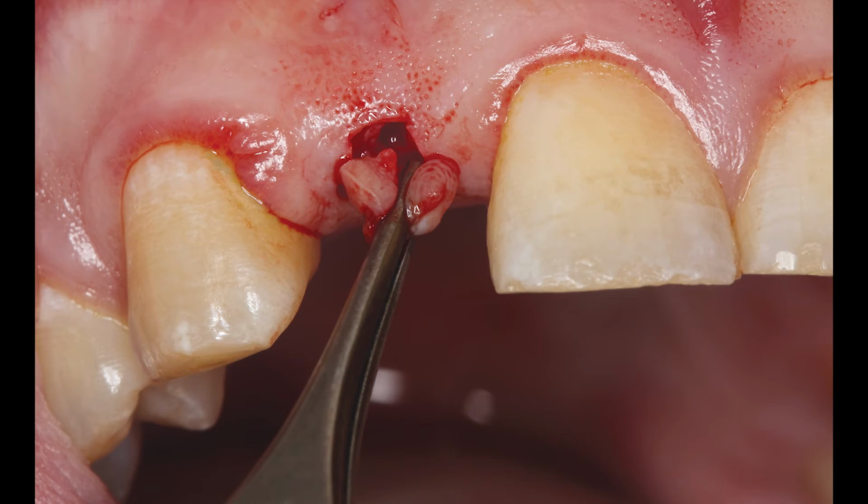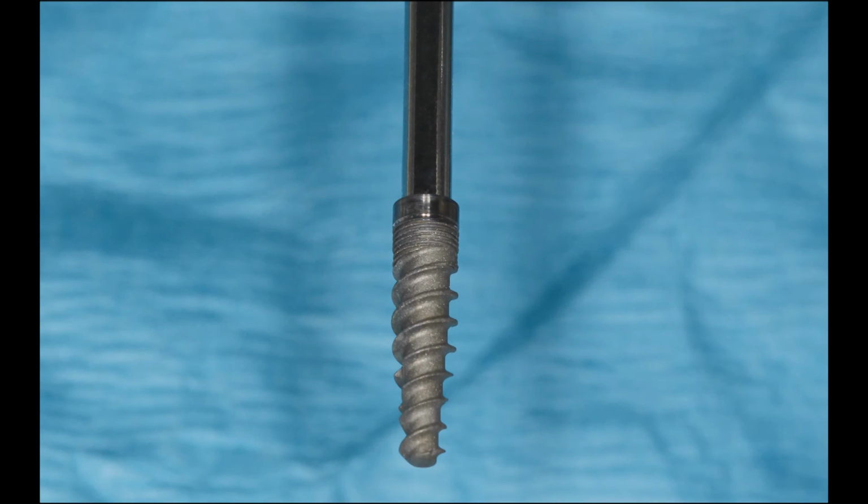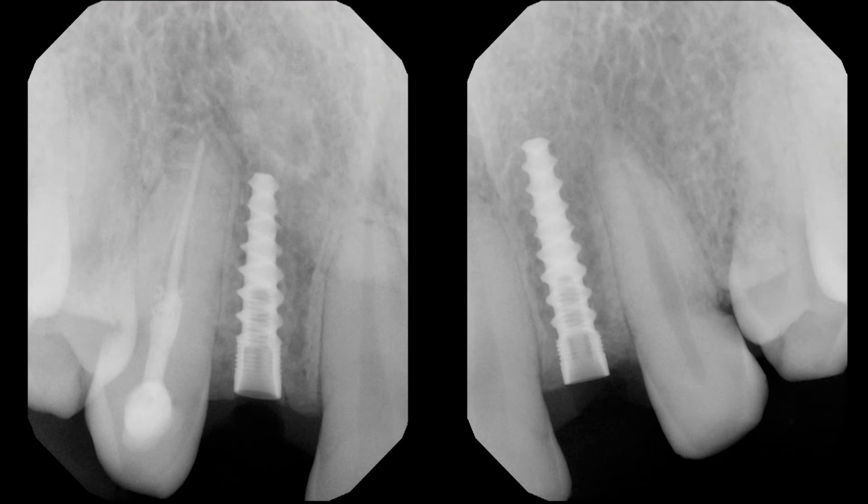A tissue punch was then used, which removes the tissue above the osteotomy preparation, ensuring that epithelium would not penetrate into the socket. The Hahn tapered implant system surgical kit was used to create osteotomies slightly smaller in diameter than the 3 millimeter diameter implants chosen for this case. An implant length of 11.5 millimeters was used for the maxillary right incisor and 13 millimeters for the maxillary left incisor. The diameter, length, and tapered body of the implants were ideal for the limited space available.